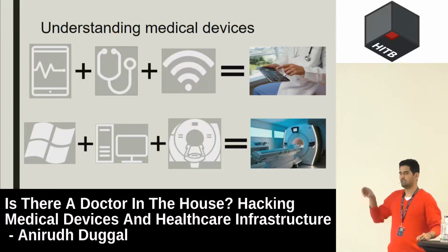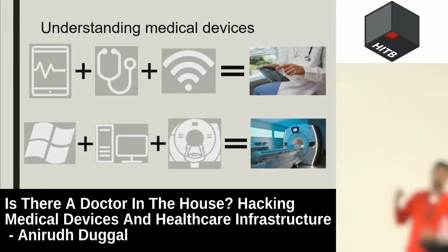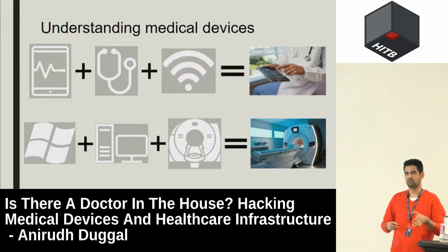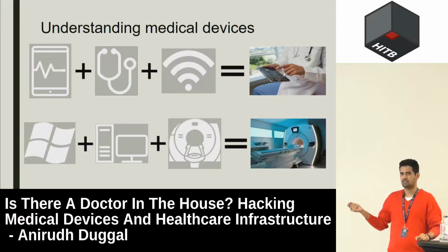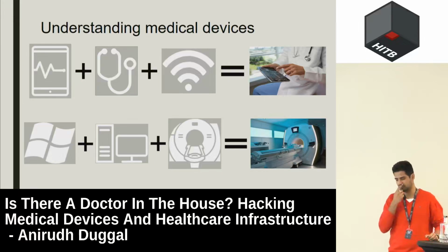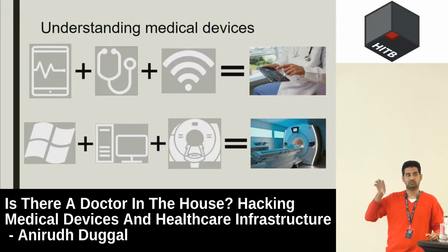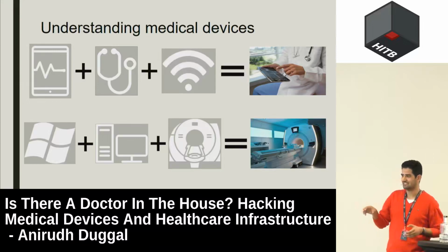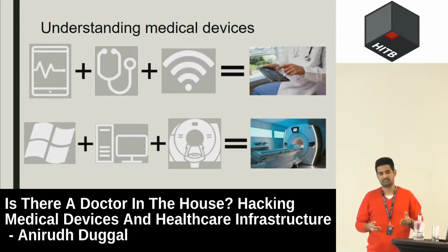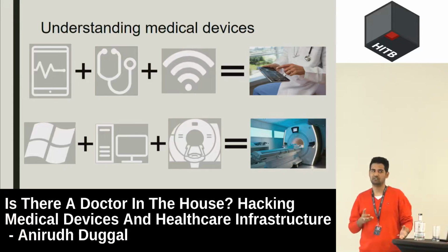Same goes for small devices like patient monitors. They will have stripped down versions of Linux. You'll run some proprietary software over it, and then you'll connect it with sensors, and these can be huge. I remember testing one of the CT scan machines. It had 4 components which were driven by Windows XP, which is really cool. So again, yes, these are all operating systems that you know. Most of the vendors say that it's a proprietary OS and we will not give you any information.